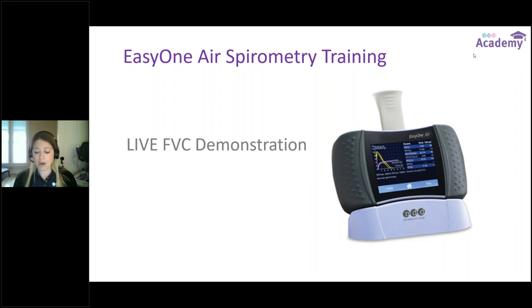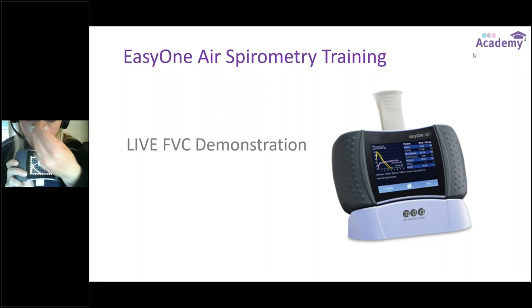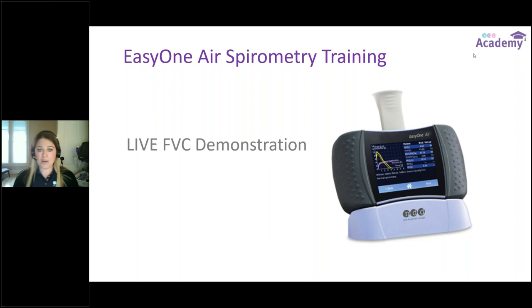I click Add Trial, instruct the patient to make a good tight seal — deep breath in and blow it out as hard and as fast as possible. The trial ends; the audio cue gives the alert that it's done. Now my coaching bar says Session Complete, telling me to go view the test results. I click on that to move to the results screen.